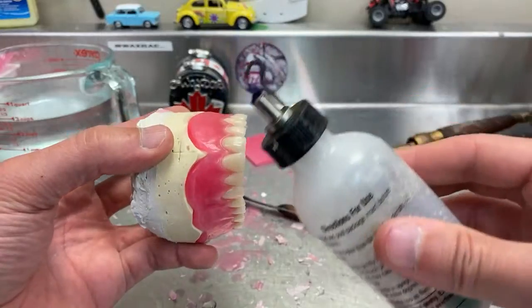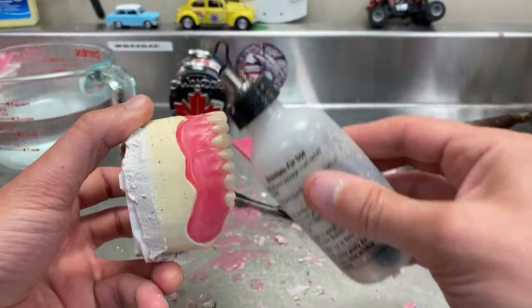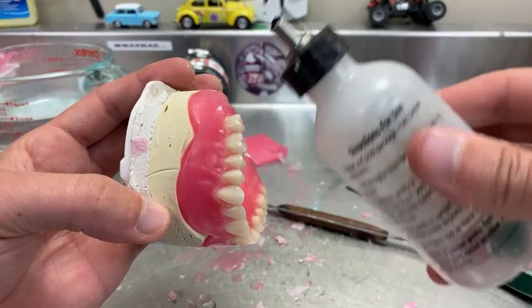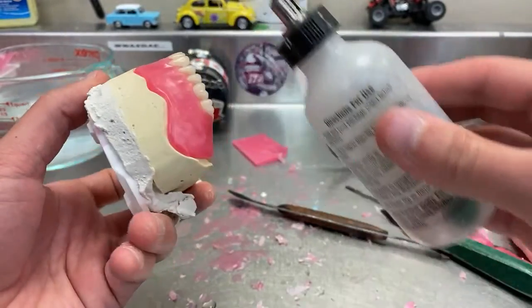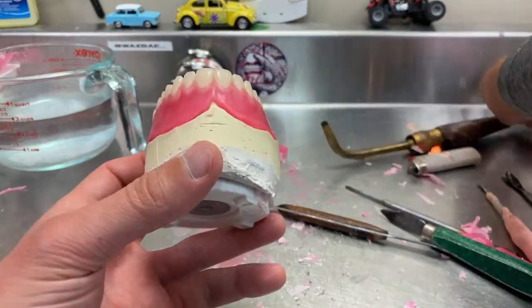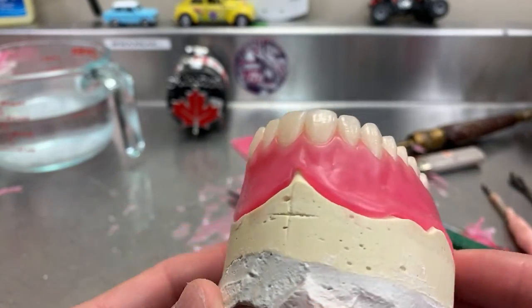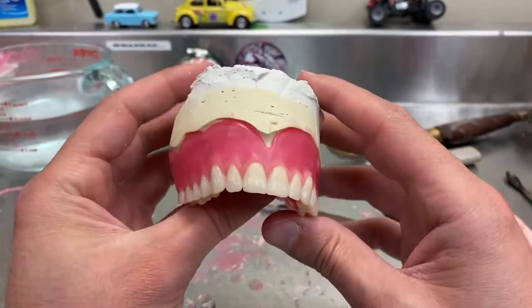Sorry, I was talking about Celine Dion and I forgot to talk about this. So what I did is I hit the necks of the teeth, and now I'm smoothing everything on top of it, all those scratches and everything, trying to blend it. Don't overheat it, because you'll be losing the details. And now, if you see, all these details are gone, except a little bit here, which is okay for now. And all you're left with is those roots under.